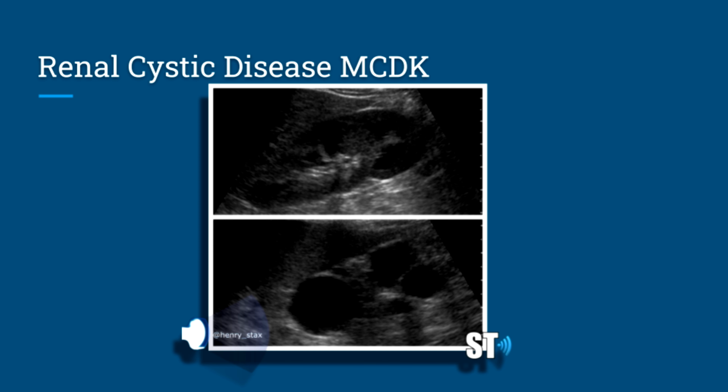Here we have a case of a right normal kidney and the left multicystic dysplastic kidney. I have many cases, but they pretty much look all the same.